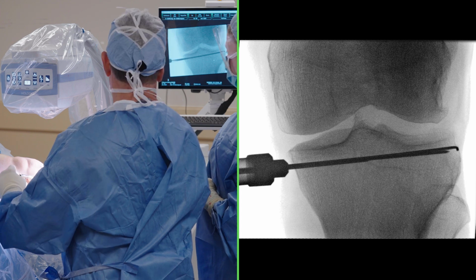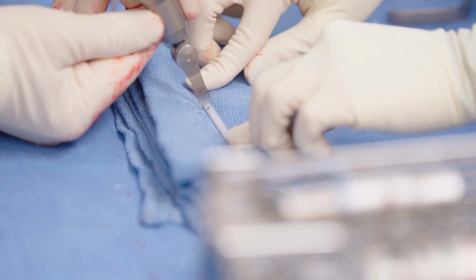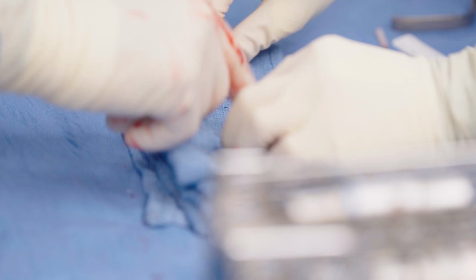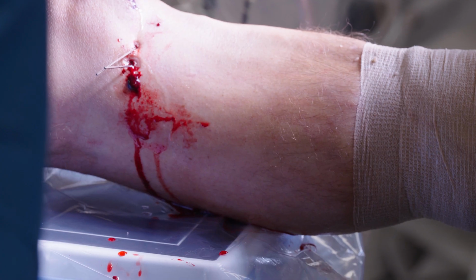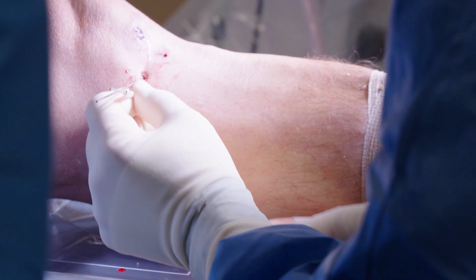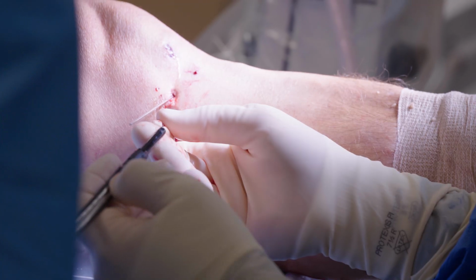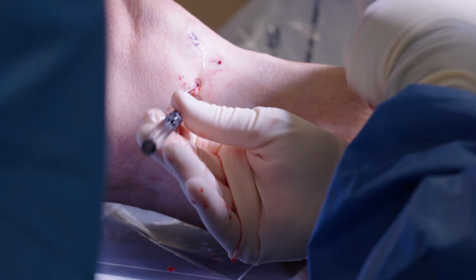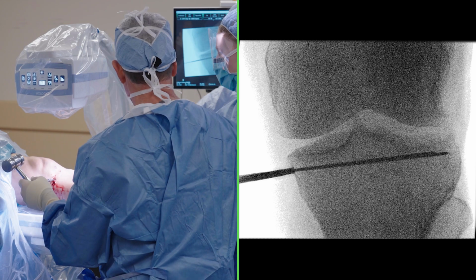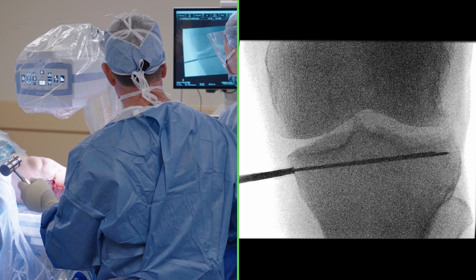So we'll cut our pin down to length that we determine both with our indirect ruler as well as our direct depth gauge measurement. We'll impact the pin. Impactor. Mallet. The objective here is just to basically seat the impactor on the near cortex counterforce. So I'll use the C-arm to confirm we know we're juxtaposed to the tibia, so I'll stop there.